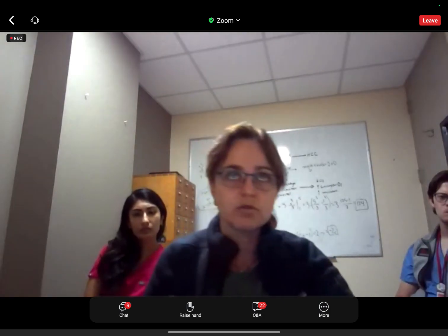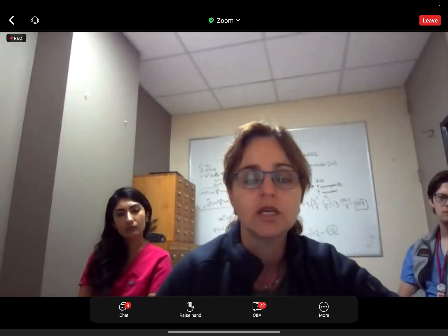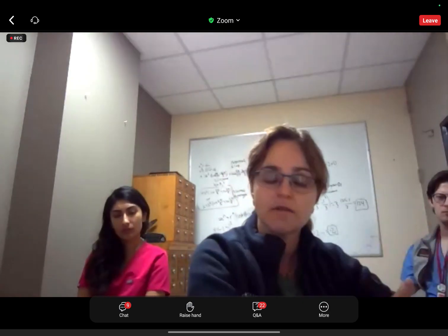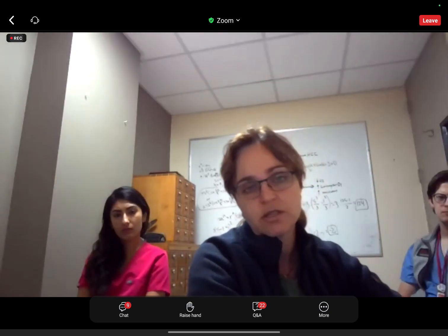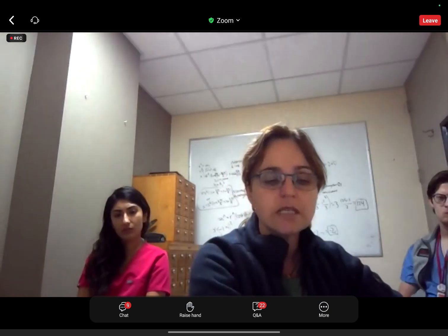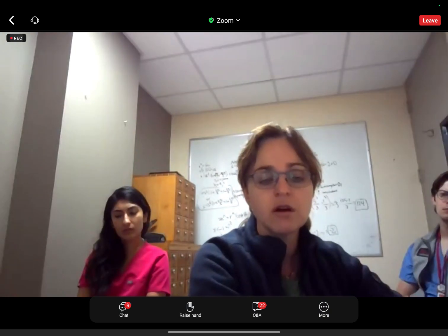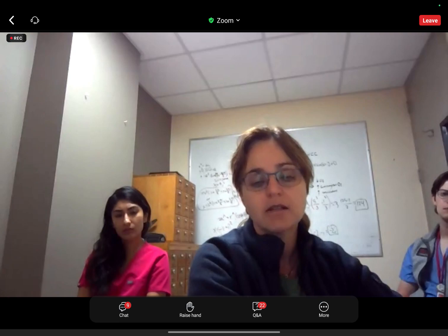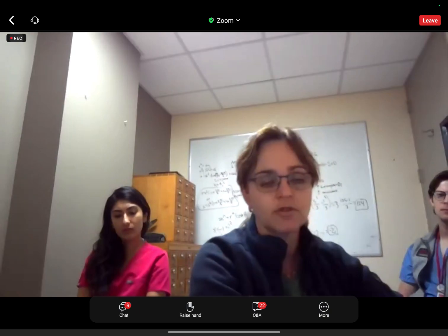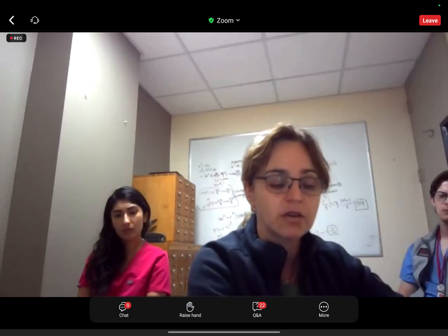However, because these recommendations are 7 years old now, there were some scanners that just could not handle b800 at the time. So at this point, b500 is still acceptable, but really it should be b800 or higher. In terms of ADC quantification, it's an excellent question. There are a number of studies that looked at using quantitative data from ADC map and looking at detection of HCC, stratifying aggressiveness of HCC.